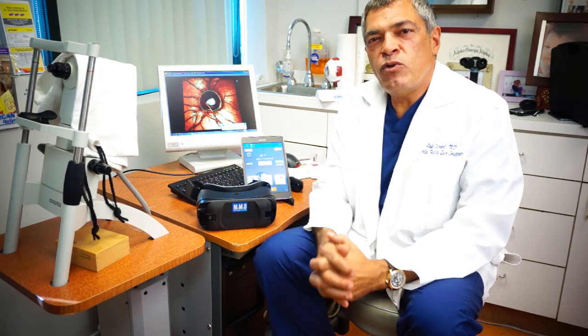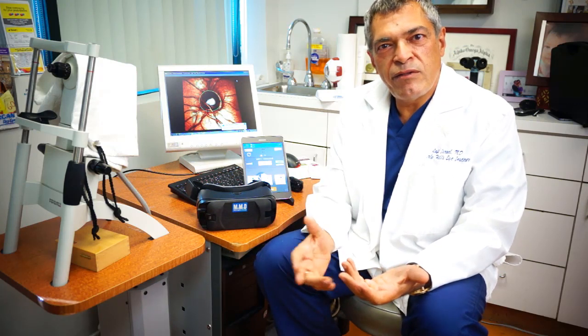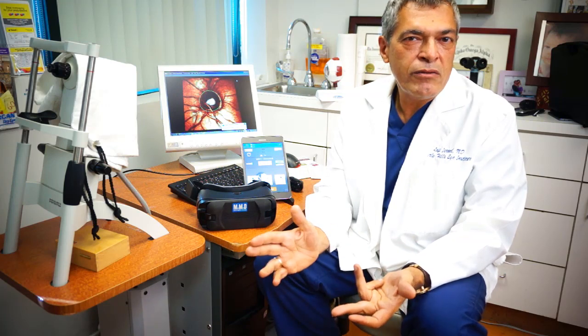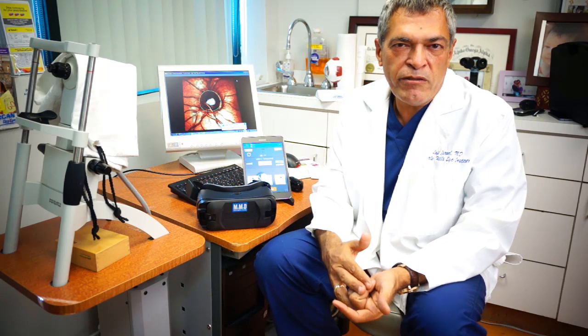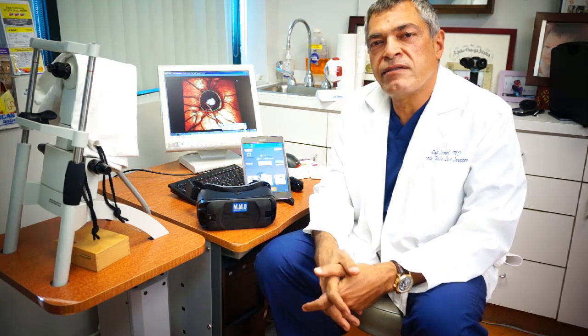As an ophthalmologist, I can tell you that a visual field analyzer is one of the most used devices in my office. There are virtually numerous diagnoses that I use the device for, most commonly for diagnosis of glaucoma, ptosis, or neuro-ophthalmological diseases that I encounter every day in my practice.